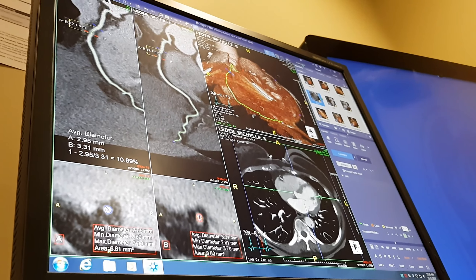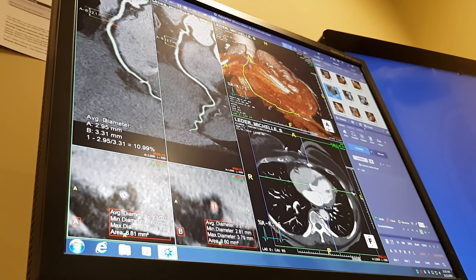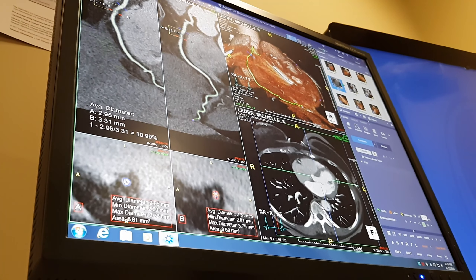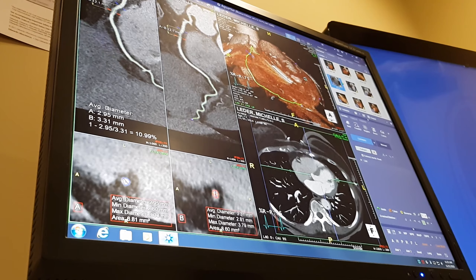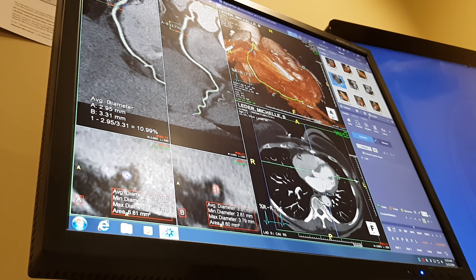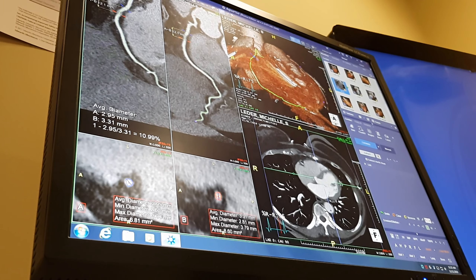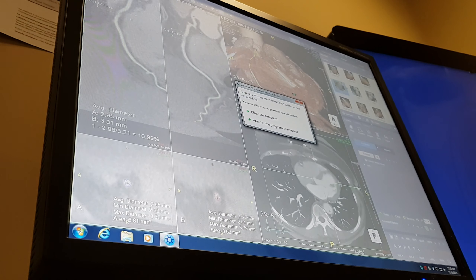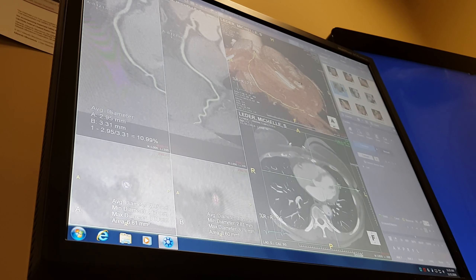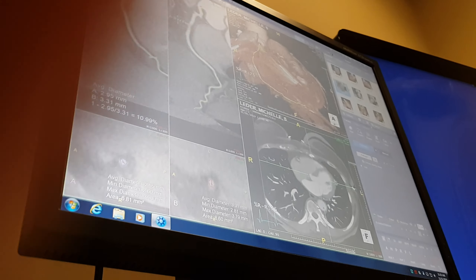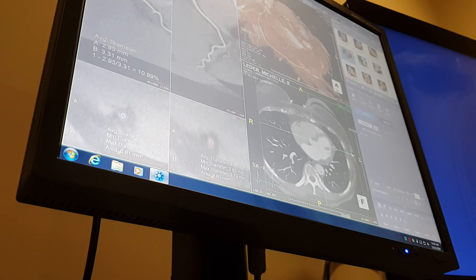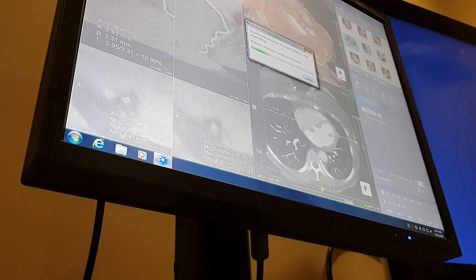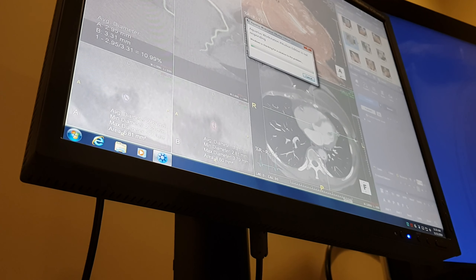I hit a button I shouldn't have — now the computer is trying to do something. So this is the heart, and the picture on the top right is a three-dimensional reconstruction. The big thing at the top is the aorta.